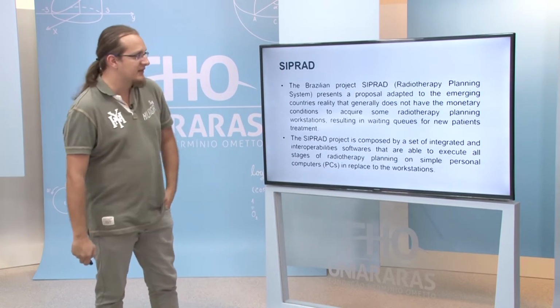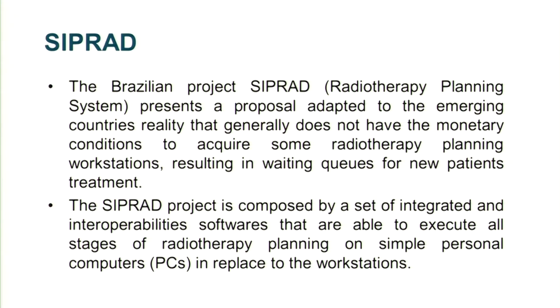SIPRAD is a Brazilian radiotherapy planning system that presents a proposal adapted to the reality of emerging countries like Brazil, South Africa and India, which generally do not have the monetary conditions to acquire radiotherapy planning workstations, resulting in wait queues for new patients.